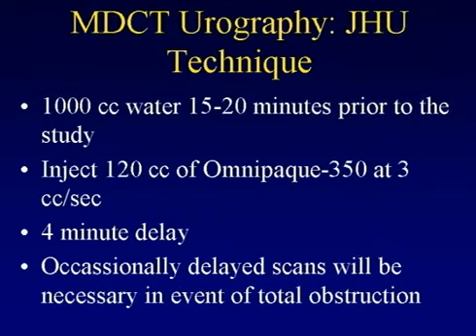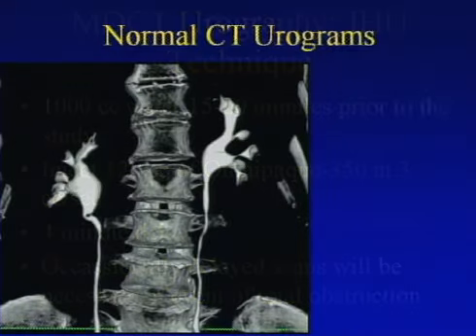We tend to do it a fairly simple way. We give the patient a large water load about 20 minutes in advance of the study. That tends to hydrate them well, and then we'll give them contrast. We'll wait 4 to 5 minutes, and then we'll get delayed scans. Ideally, what you'd like to do is, before you get the final images, have the patient rotate on the table so the contrast gets mixed up, and then you get very nice visualizations.